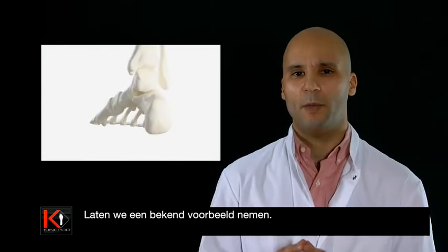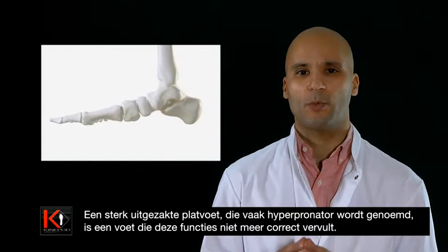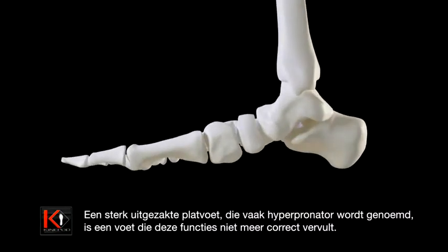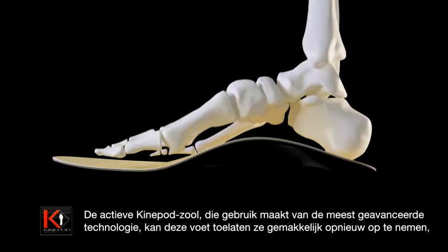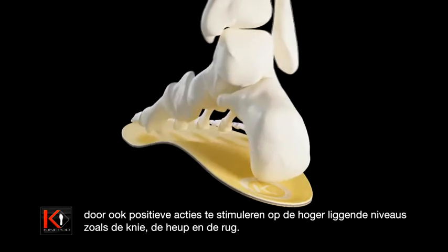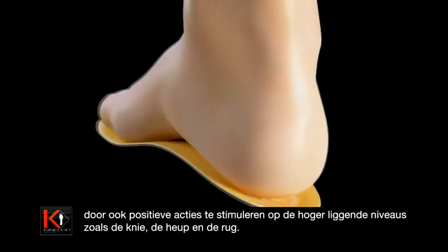Let's take a very widespread example: hyper-eversion in a flat foot, more specifically referred to as a hyper-pronated foot — a foot that no longer carries out its functions properly. With the benefits of avant-garde technology, the active Kinepod sole helps the foot to recover these functions easily, thus inducing a positive effect on the upper body parts, such as the knee, the hip, and the back.